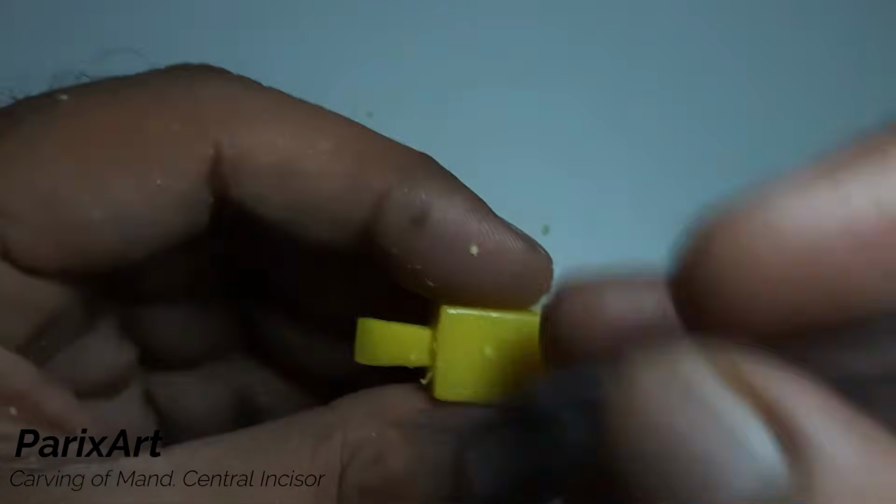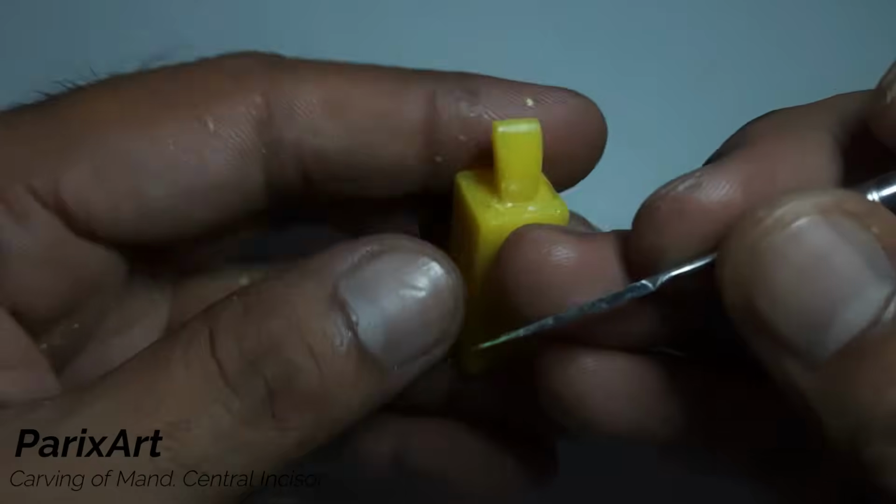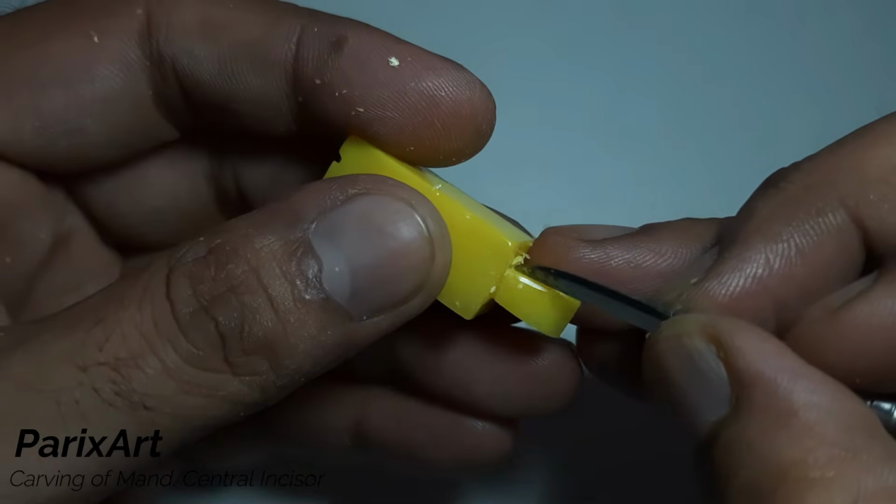Just confirm the mesio-distal width at the cervical before proceeding. Now rounding off all the labial line angles.